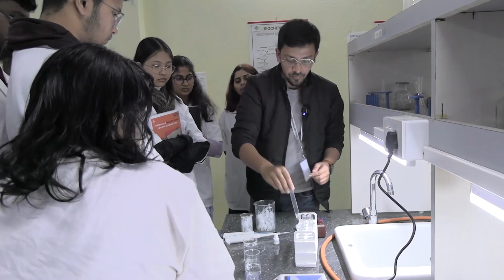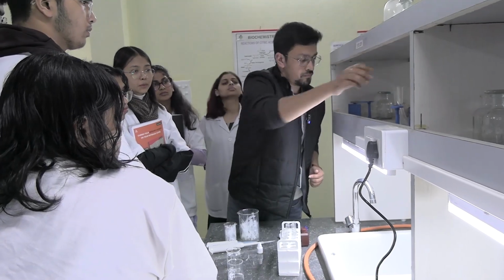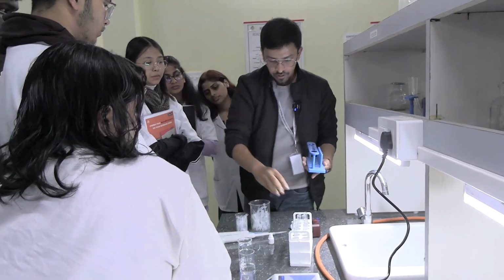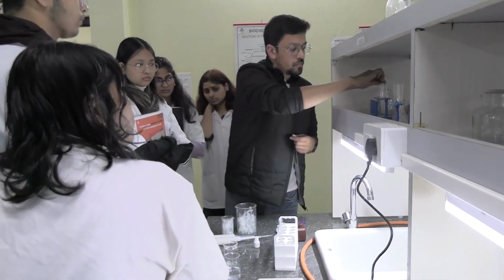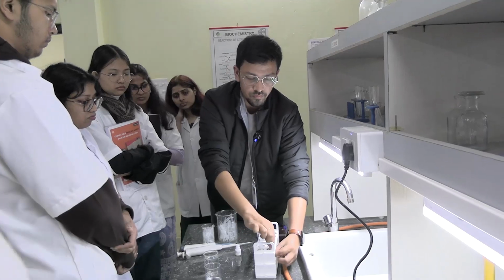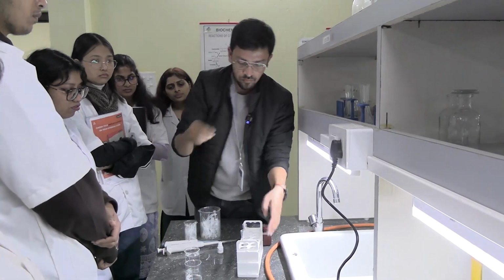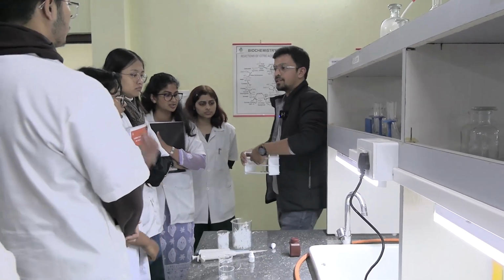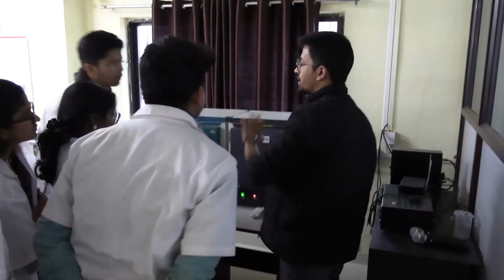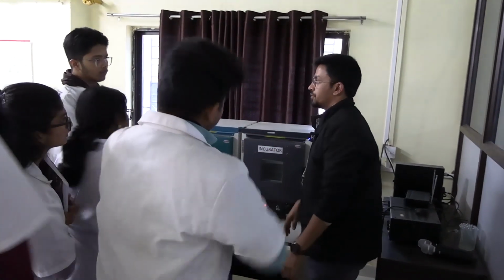Mixed up, right? Now I will take a fresh test. Okay, now I have to incubate it for 10 minutes at 37 degrees centigrade. Okay, I have to wait for 10 minutes over here. By that time you prepare one more fresh sample for yourselves.